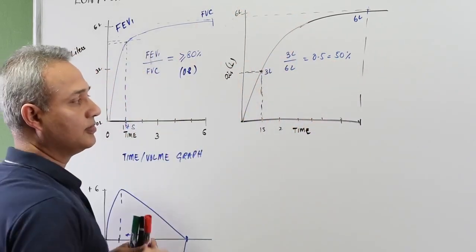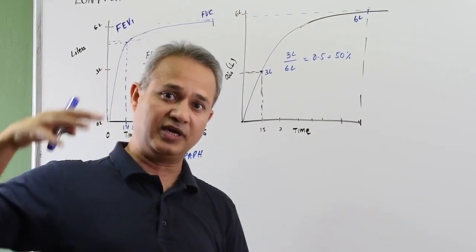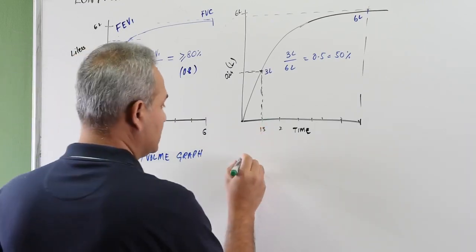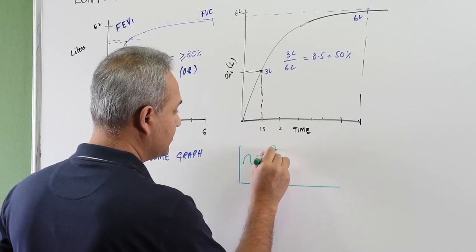How about the volume? Normally the patient's volume increases with emphysema: dilated lungs, big lungs, so the volume increases. So if I make the patient's graph that I made before, this is tidal volume.